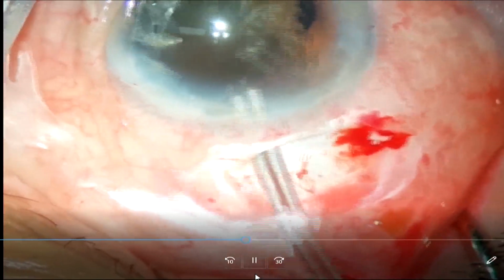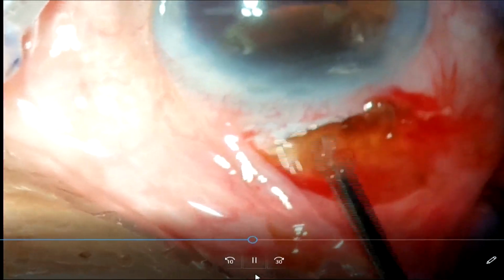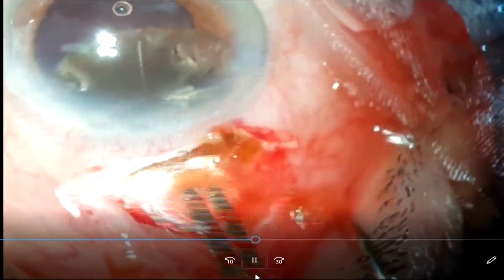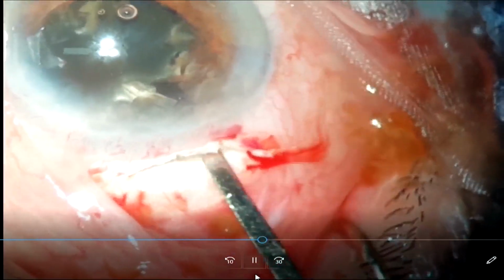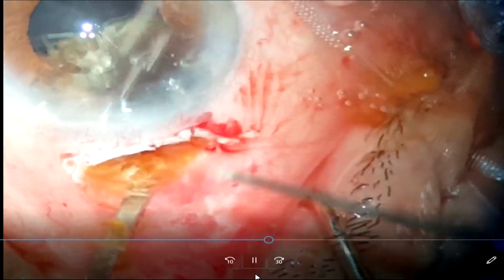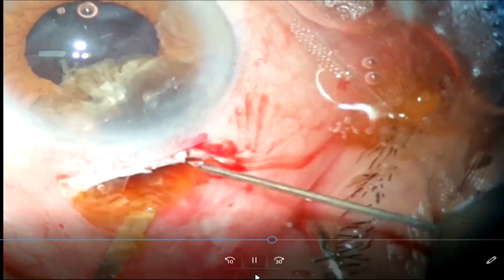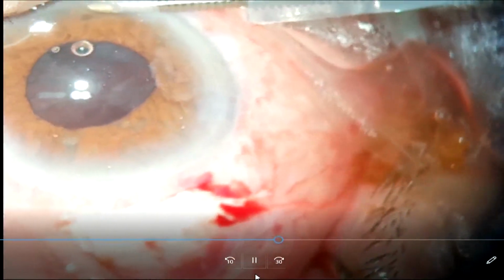Now see, the nucleus has become smaller. I again inject the viscoelastic and re-engage the nucleus. Keep chipping it to bring it out. This may take a little longer, but it is important that you make an extra effort to keep on injecting viscoelastic, otherwise your endothelium gets damaged.